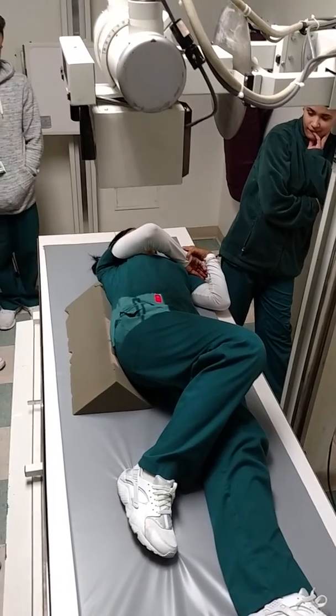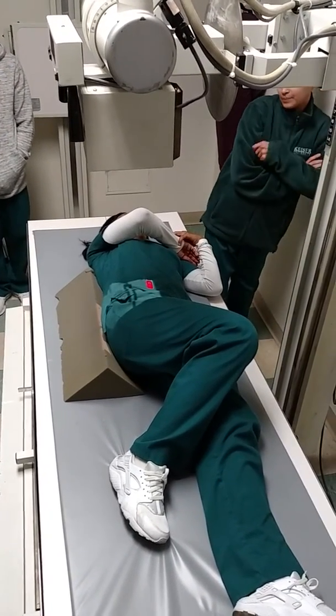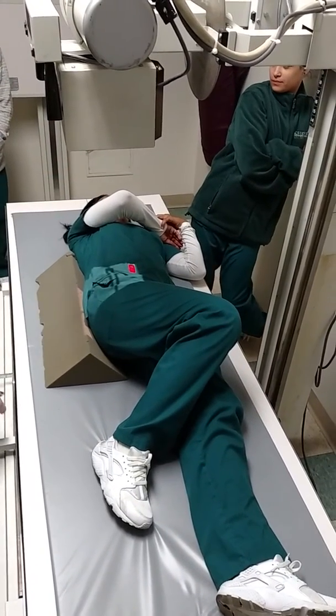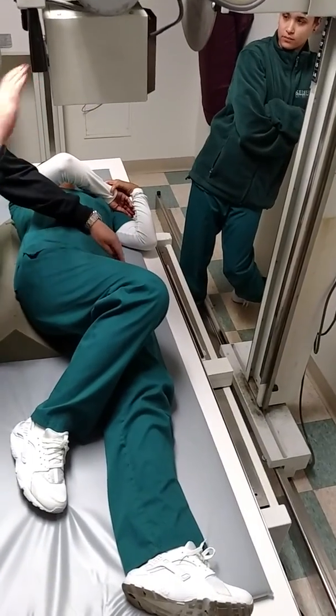That's a right posterior brim. But this position can also show something else. What else can it show? Your other side, but the anterior brim. So she's in the same position, but I'm going to start at ASIS.